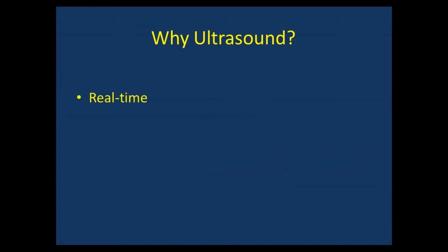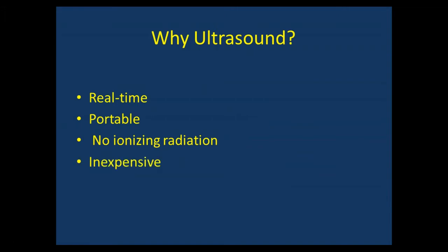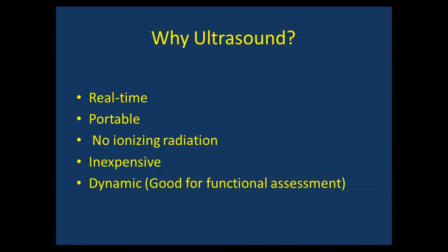But why ultrasound? It is real-time, portable, no ionizing radiation compared to X-ray, inexpensive or relatively inexpensive, dynamic. So good for functional assessment. You can assess the difference between inspiration and expiration in sick infants, and you can get an impression about lung collapse at end of expiration, for example.